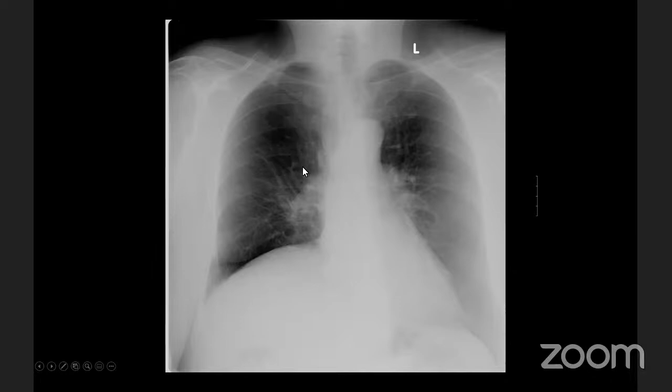That's actually what you know when you have half of the lung missing, the rest of the lung needs to expand. So there is a lot of air in there, and usually these areas in the lungs can be darker. You can see it's even darker here, because you have a lot of soft tissues around here. You have pectoral muscle in here, pectoral muscle and axillary folds, and so on. And in this area, you have much less muscle and soft tissue around the thorax. That's why it's usually darker.